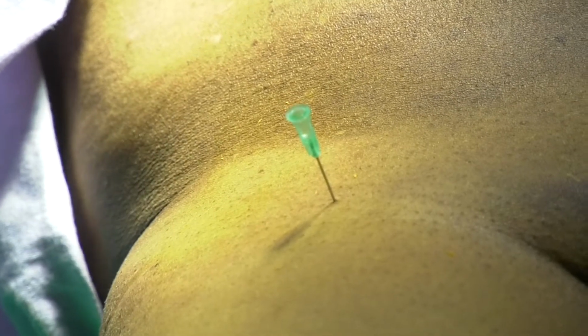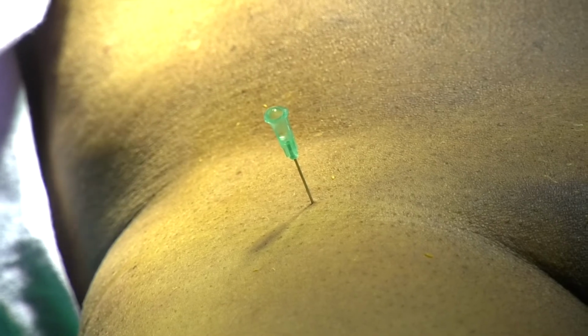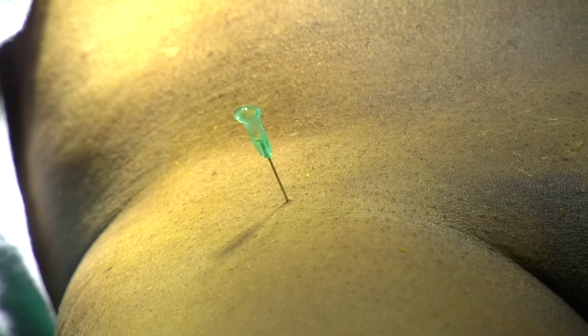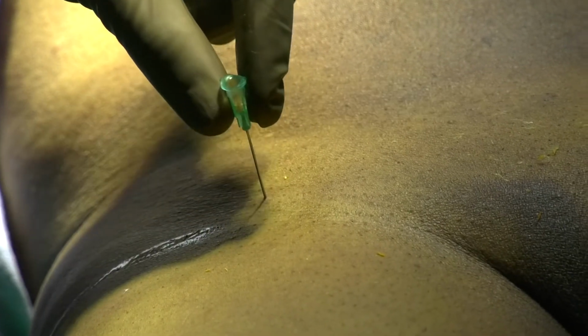Can you see the backflow? We can actually demonstrate with ultrasound, we have that, but as we are already late, just by landmark guidance.